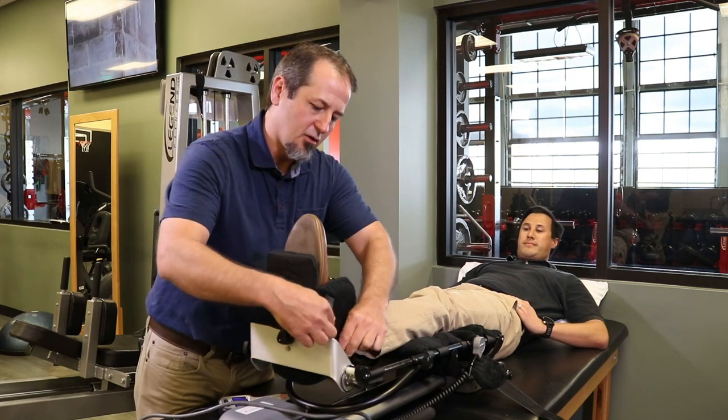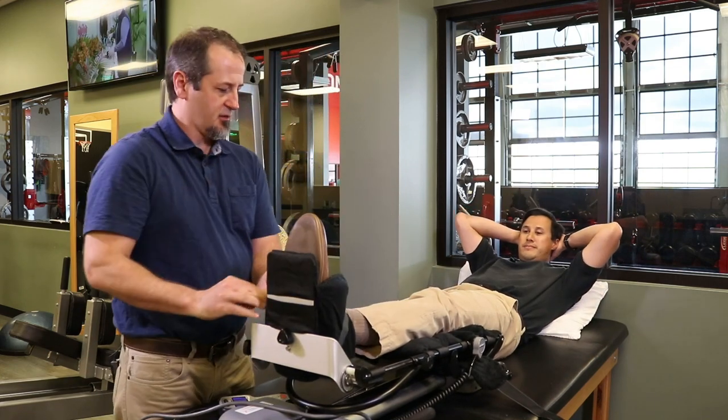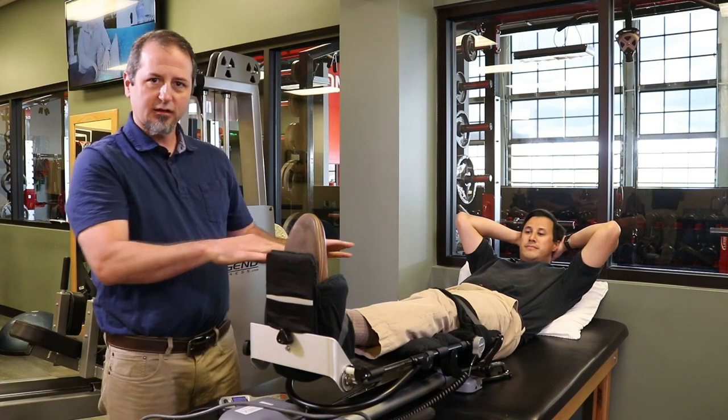When the patient's ready to use it, I always want to make sure that they strap this around the ankle, and then they can strap this band around the thigh. That's just to keep them on the correct plane.